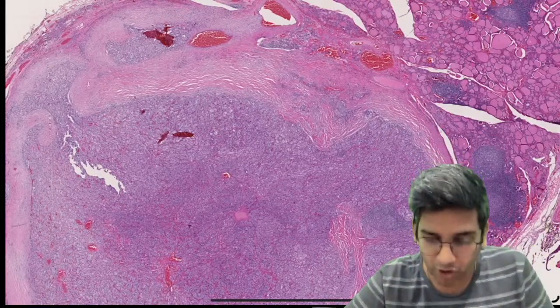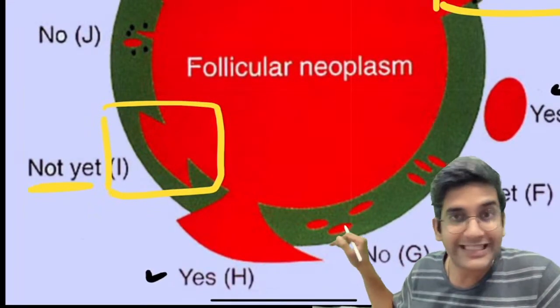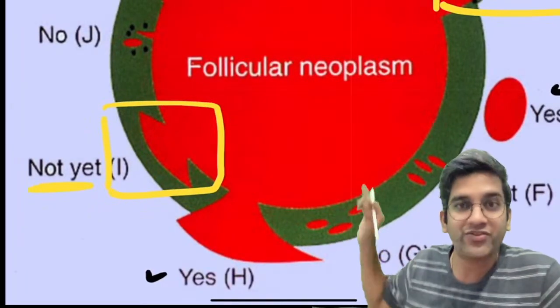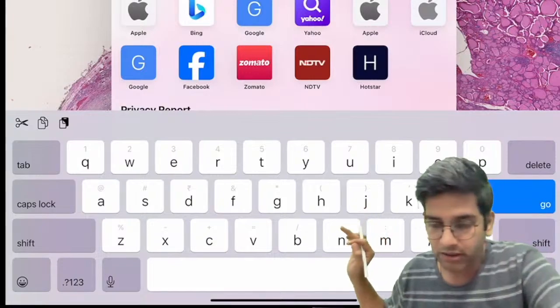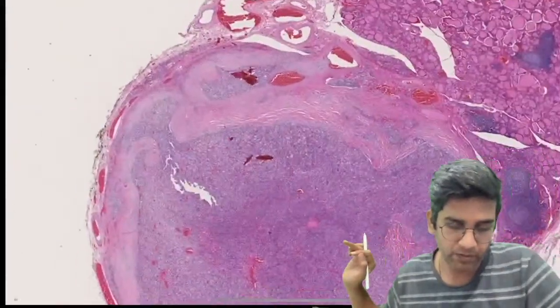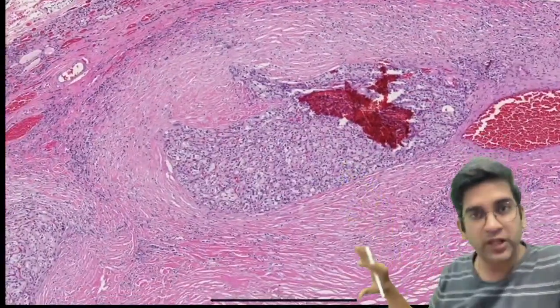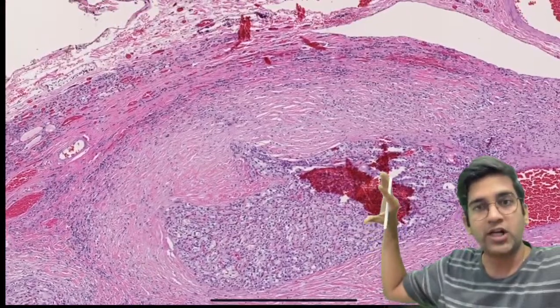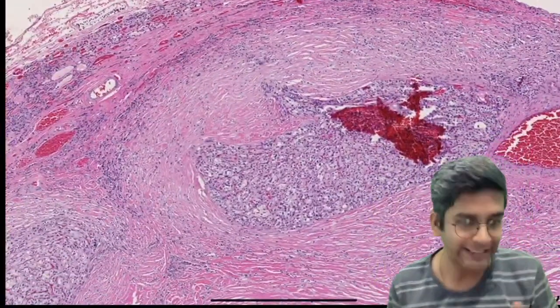So why I'm telling you is, don't get confused with this. This is not what we saw there, right? What I'm seeing here is actually a tumor which is going ahead. There's actually a tumor going into it. It's not seen within the capsule. This is my original capsule. It's gone outside the capsule and has created a desmoplastic response which is merging with the capsule. Clear? Perfect.